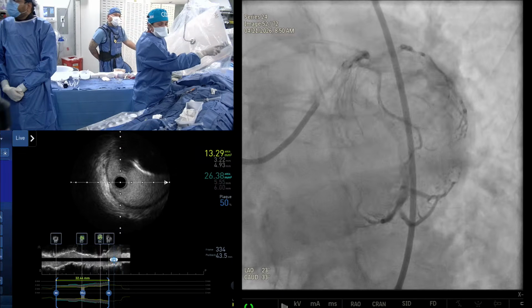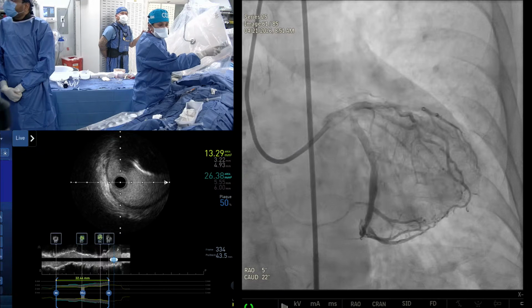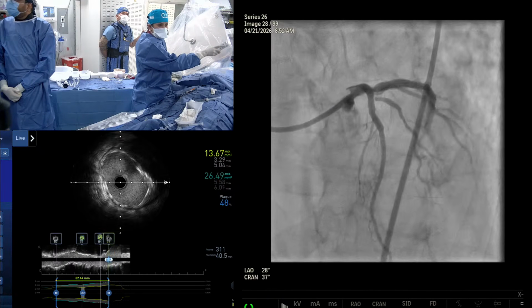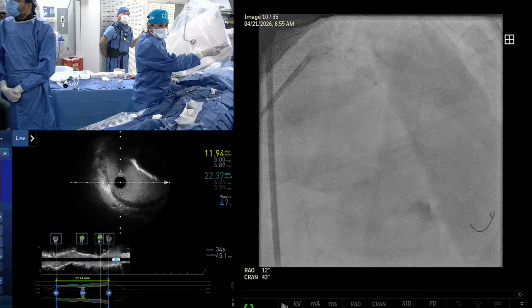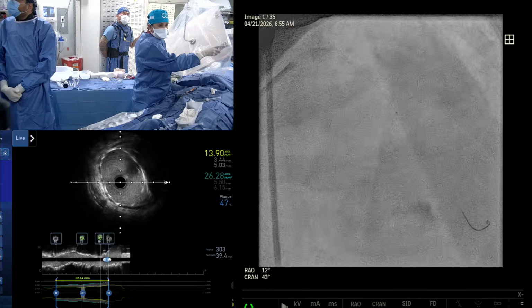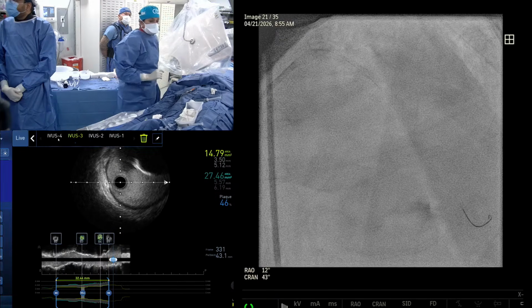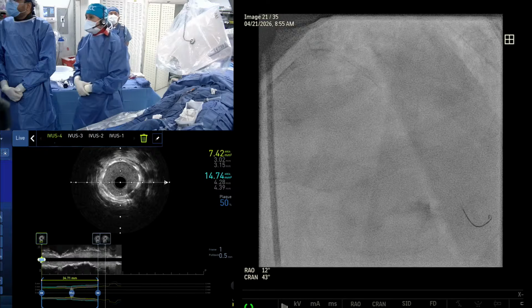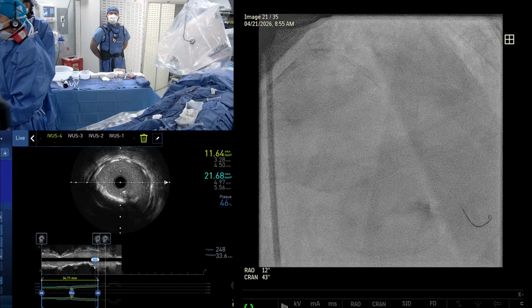I mean, IVUS. Yeah. No, it could be. Look at it. Okay. Now look at this. Yeah. Then we did multiple views. Yeah. You see that? Stable, no EKG changes, and I went back and did the IVUS again. Okay. Repeat the IVUS again. Show the final IVUS again. Sure. We did just that proximal part to see if there's anything. Anyway, intrastent it looks great.